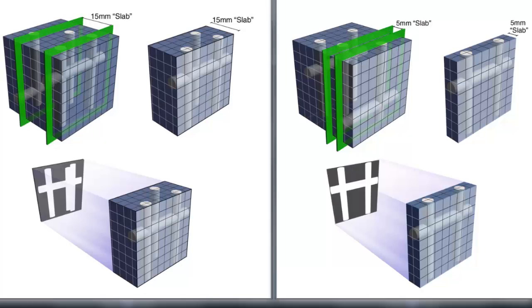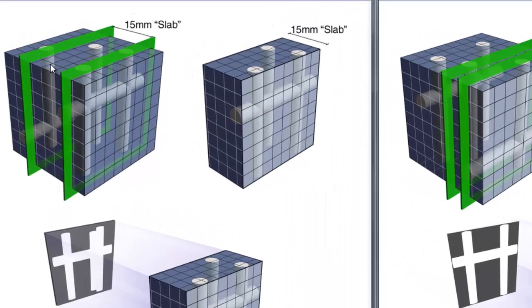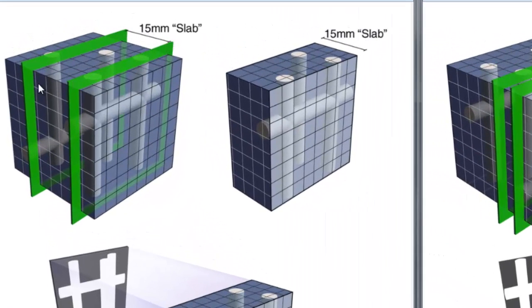So if instead of projecting across the entire brain in the z-axis we choose slabs that are not the entire extent of the z-axis but in this case let's say 15 millimeter slabs, then that means that this is our new area of volume.